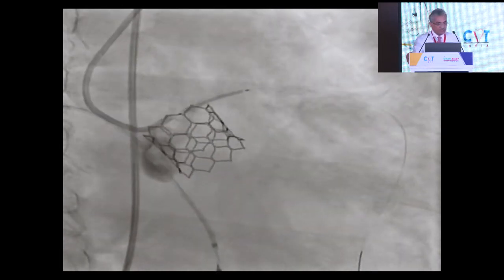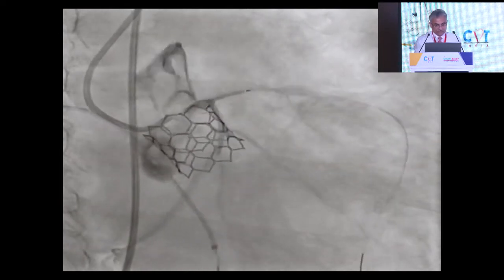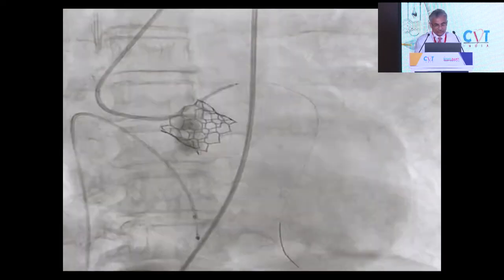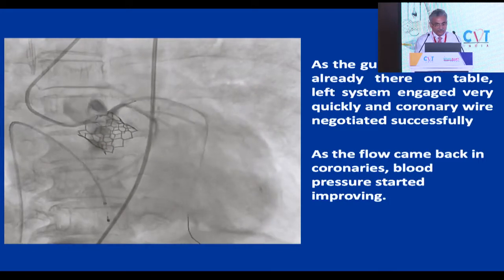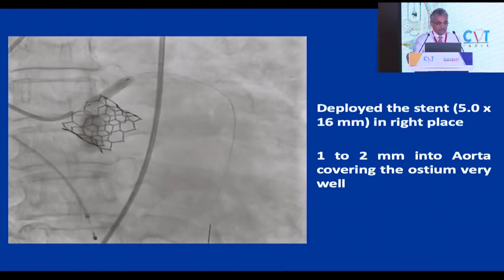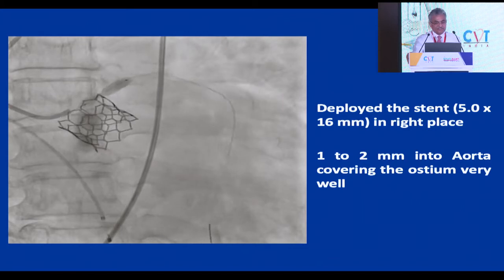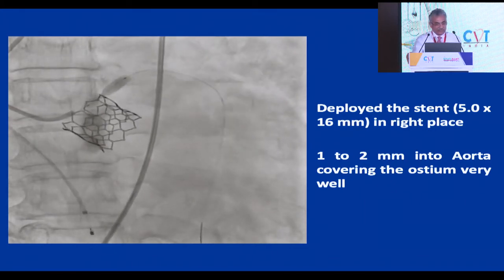And we had some time to place the stent. It was already there on the table, so we did not take much time to even search for it. After positioning in a proper manner, the deployment was done. You can see we are holding on very well. We were catching the ostium, which was required. It was a 5x16 stent deployed at nominal pressures as a routine practice.